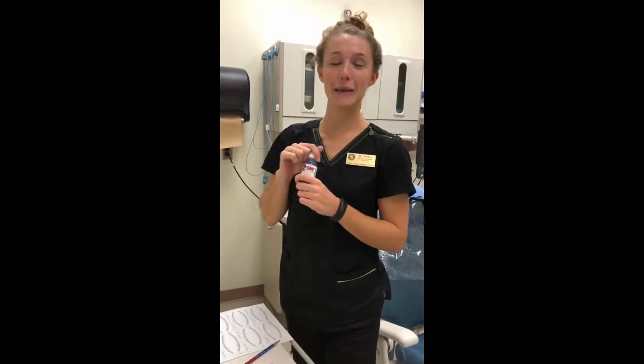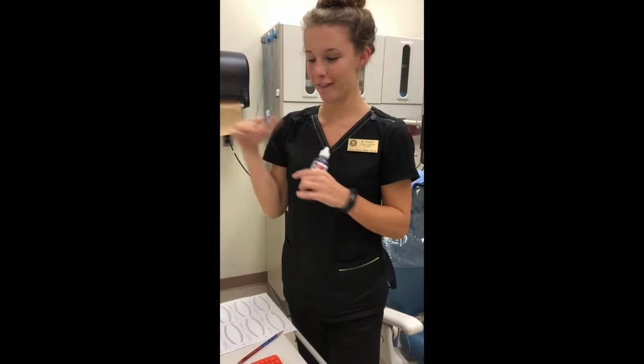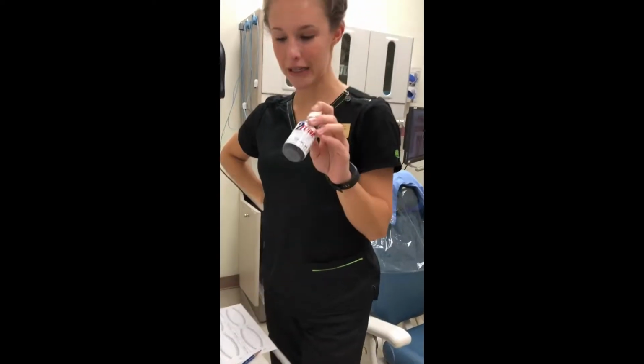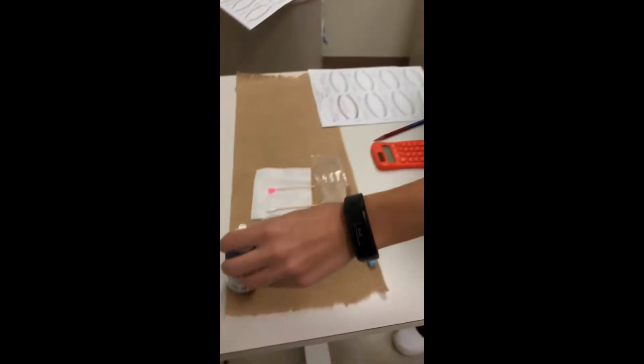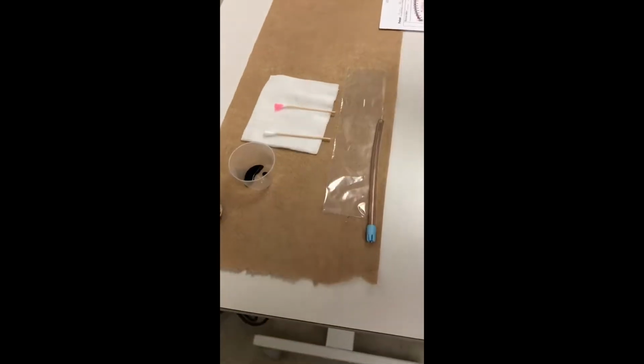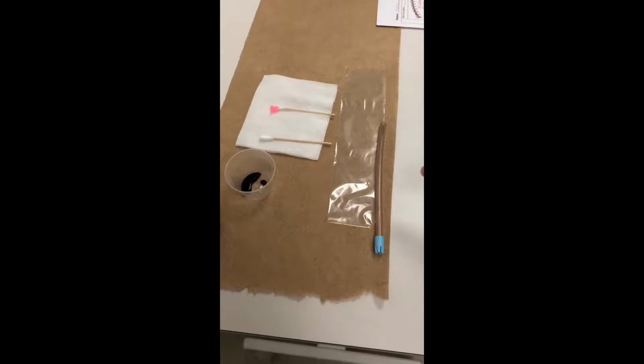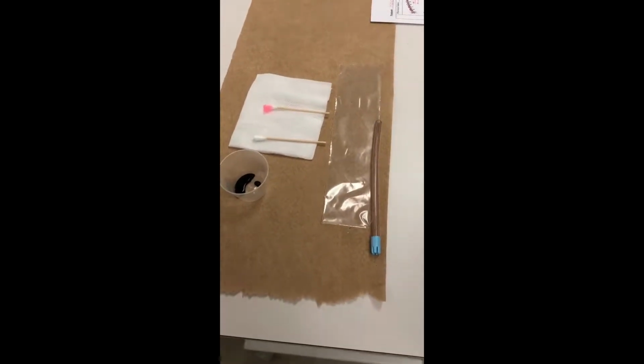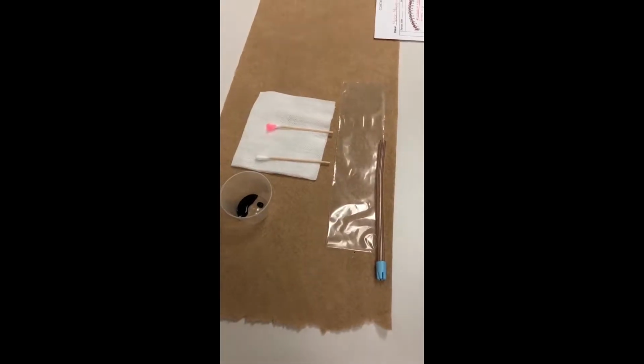To calculate a patient's plaque index, there are a few things that we need on this mask. So first we're going to need our disclosing solution and then like a little medicine cup so we can put some in there. We need a saliva ejector and then a barrier for our saliva ejector. And then we need 2 cotton tip applicators.